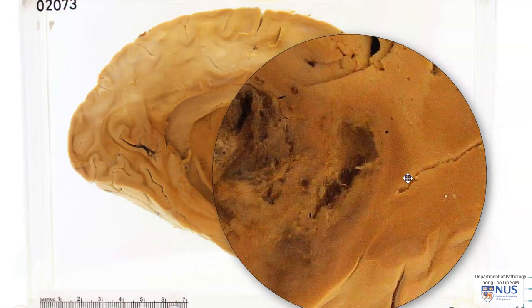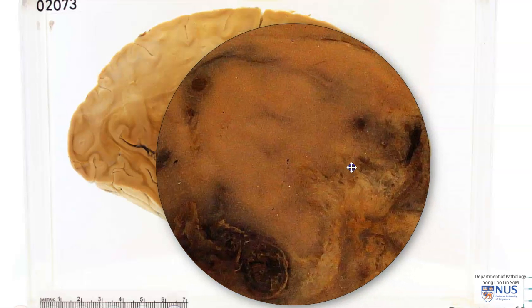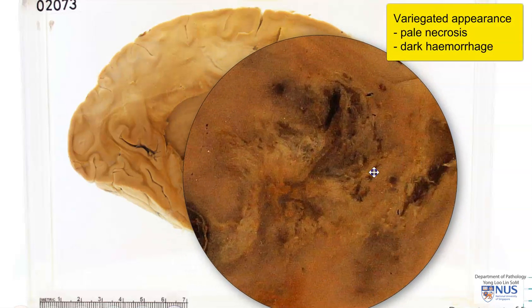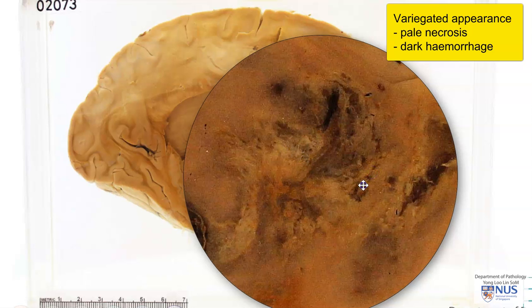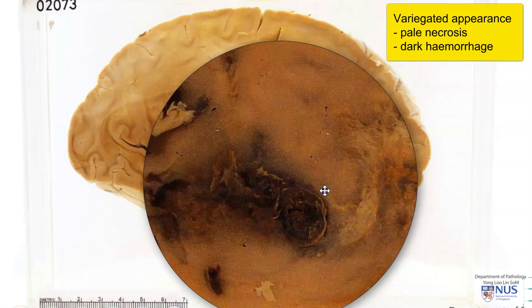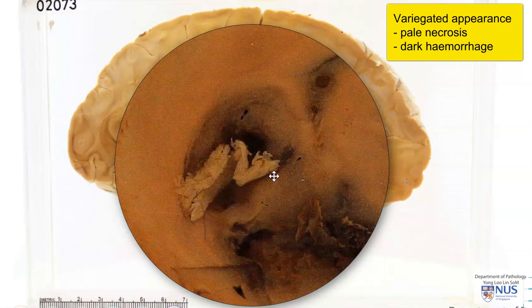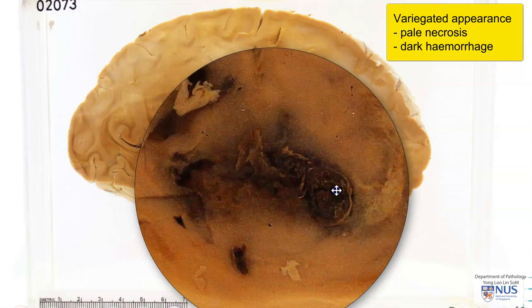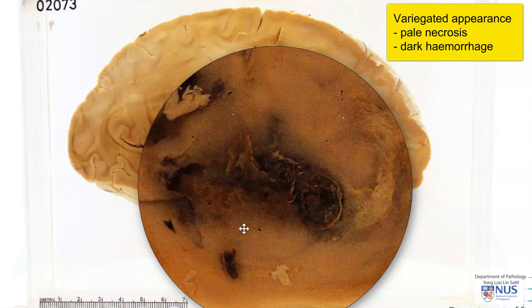It is ill-defined and tan in color. It is quite fleshy and variegated because we can see pale areas and also dark areas. This pale area actually represents necrotic tumor tissue, and this dark area represents hemorrhage.